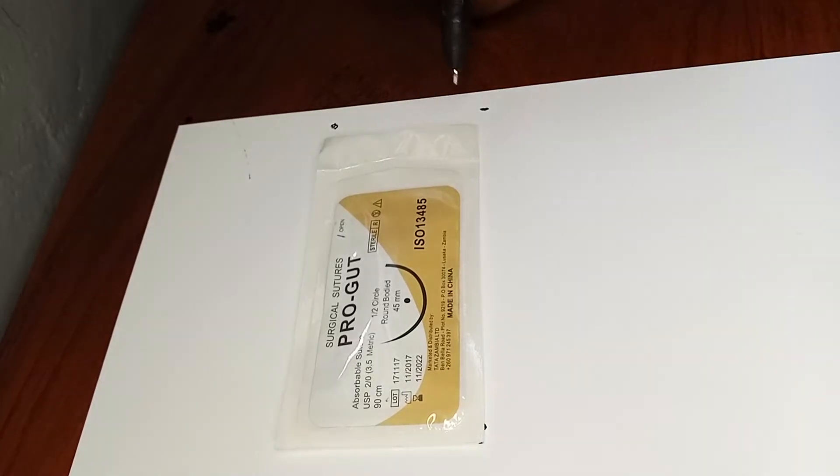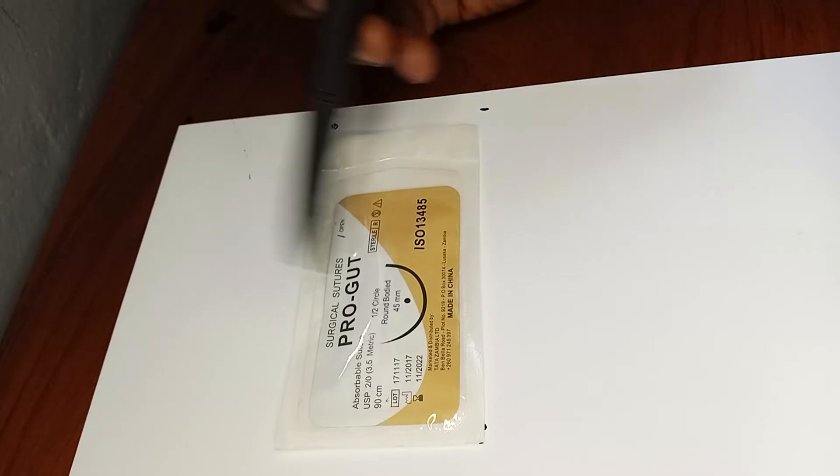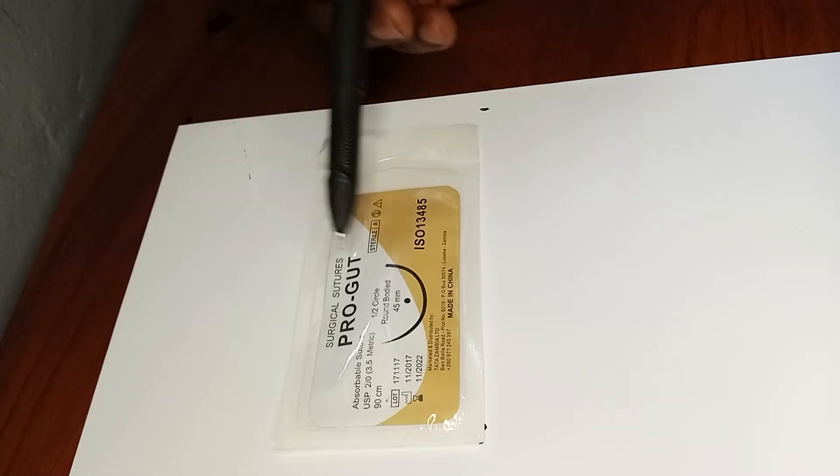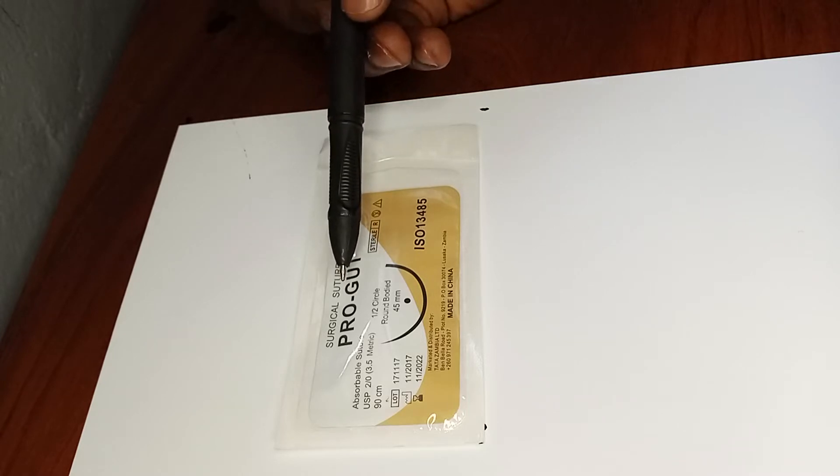I wanted to talk briefly about sutures today. We have a suture here that we'll use as an example to demonstrate how to look at sutures. When you get a suture, one of the first things you need to look at is what suture you have. In this case, we've gotten an example of a chromic catgut suture.